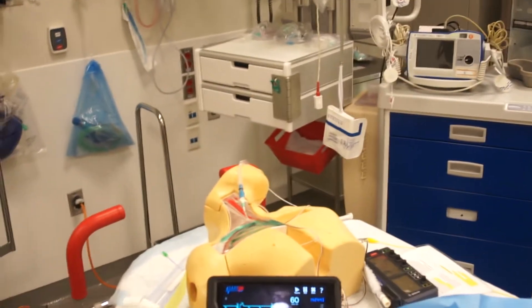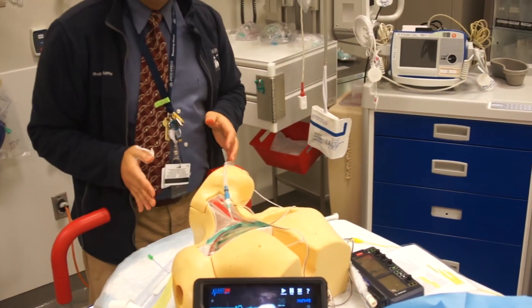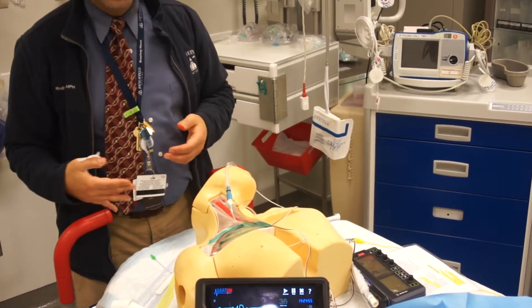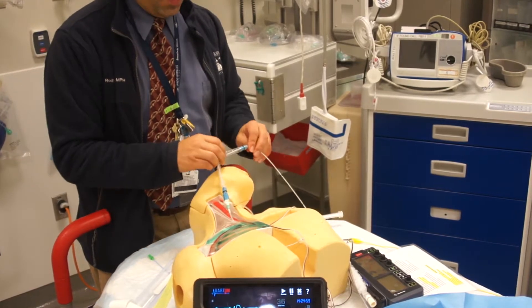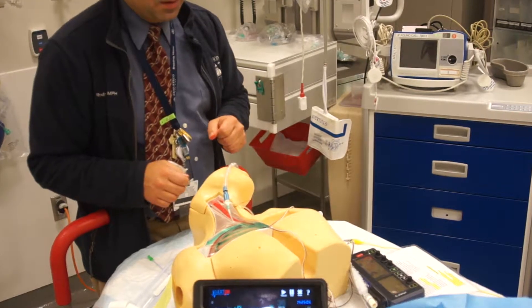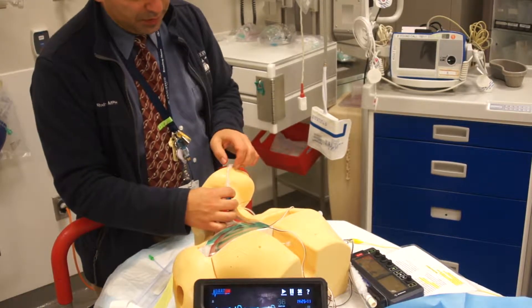This is the final lesson. The thing I recommend is a two-doctor and nurse technique. One of the doctors should be looking at the heart with the ultrasound machine because this catheter is quite radio-dense and ultrasound-dense — you'll be able to see that tip when it's in the ventricle. So as you're inserting this, you'll also be able to look for complications.